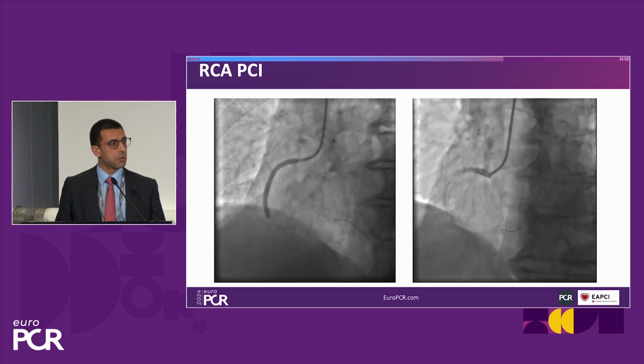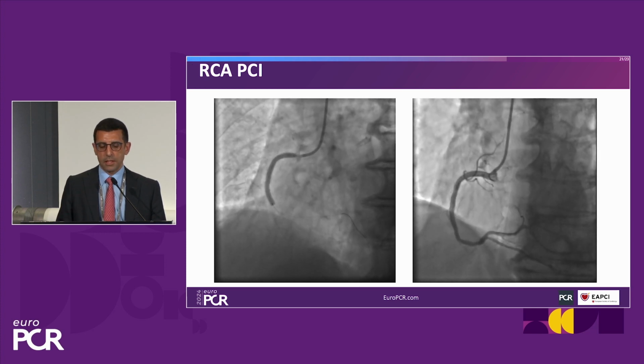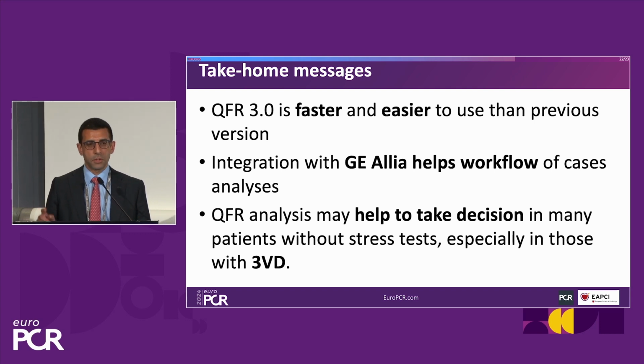The patient, 2 months have passed, he's still okay, now he doesn't have angina. So these are my take-home messages. As you have seen, QFR is faster, easier to use. To me, both characteristics are important, not only the time that you consume, but also the fact that you just have to click on the next, so you don't have to make much more drawing.